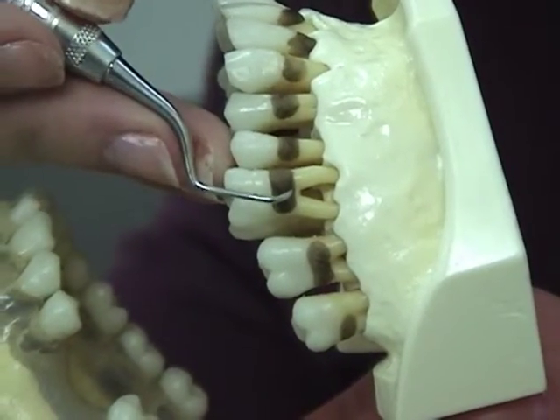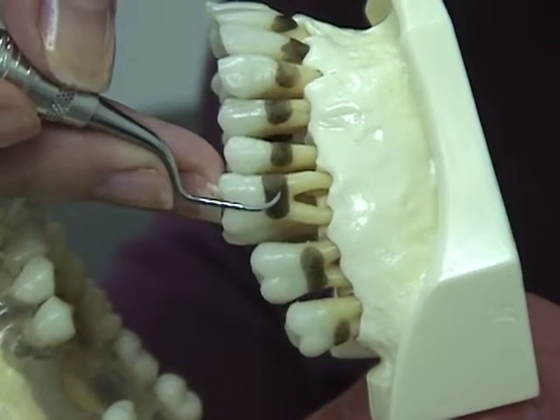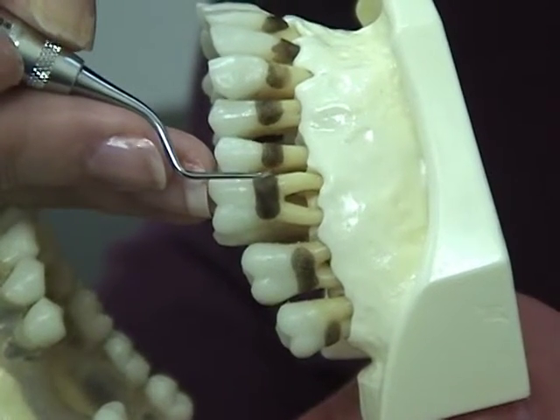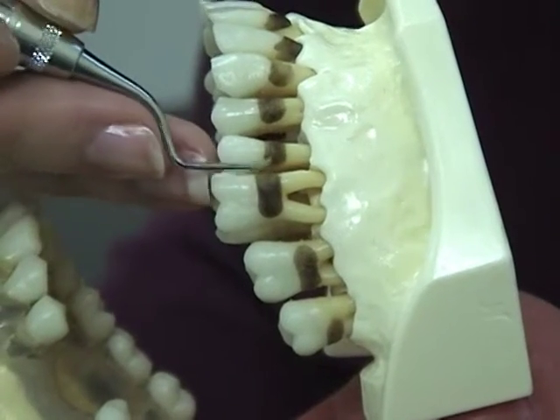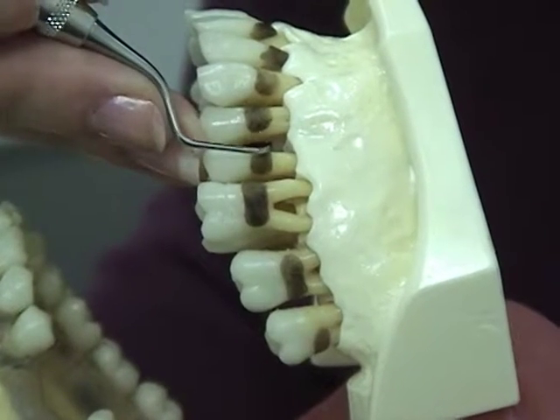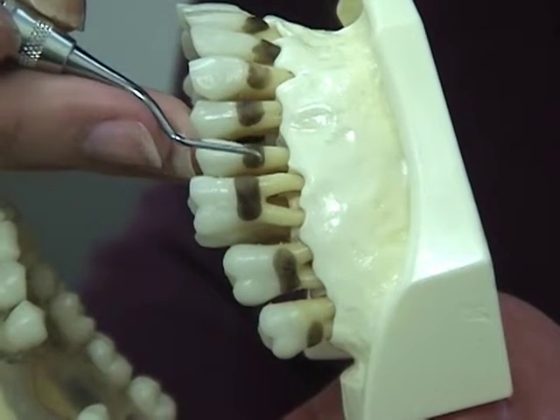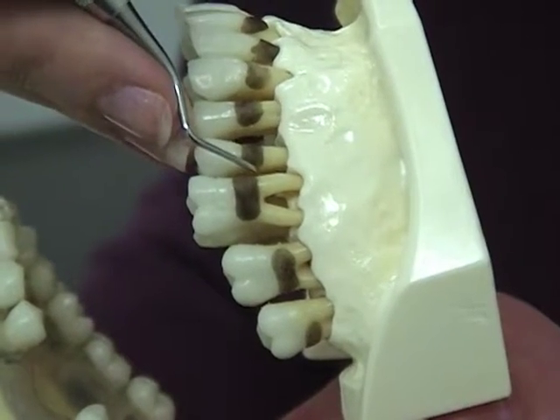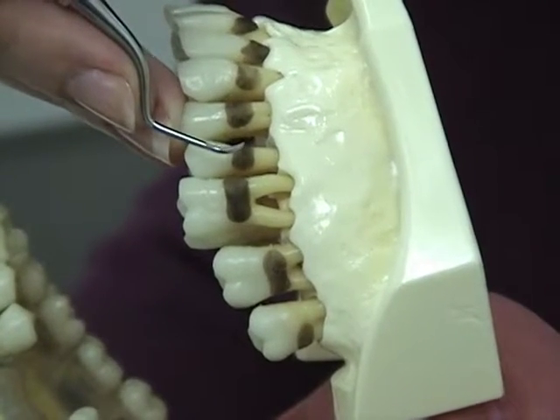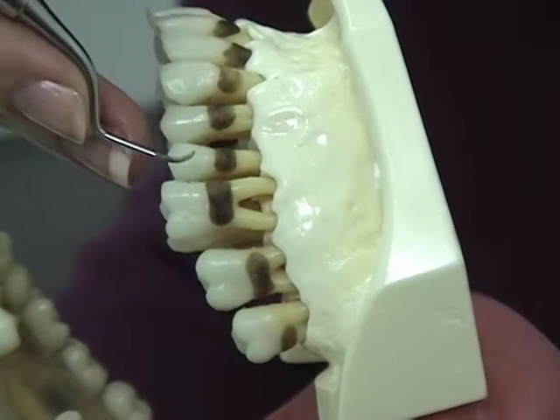Adaptation, angulation, and insertion. Adaptation is the positioning of the first one to two millimeters of the working end of the instrument against the tooth surface. This area must be in contact with the tooth surface throughout the instrumentation stroke. Only the leading section of the working end contacts the tooth. To determine correct adaptation, you must first be familiar with each instrument and the correct working end. The tip does not come in contact with the tissue.